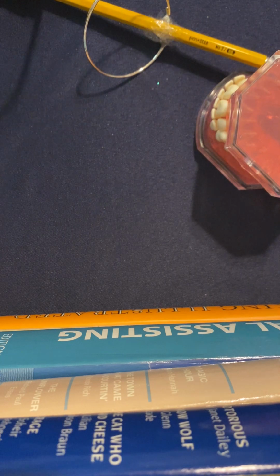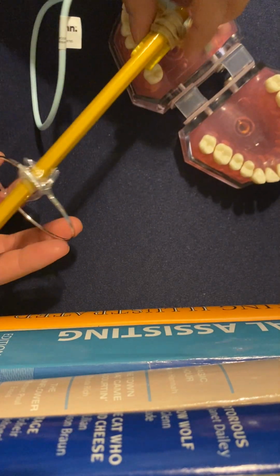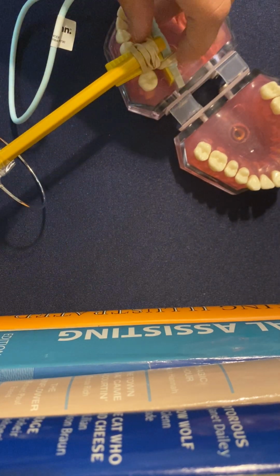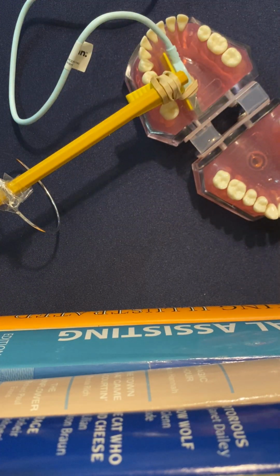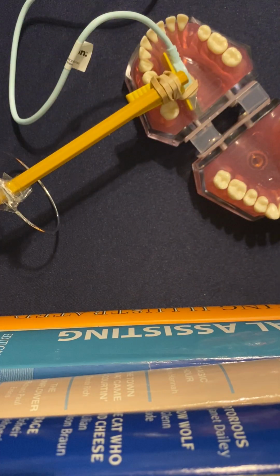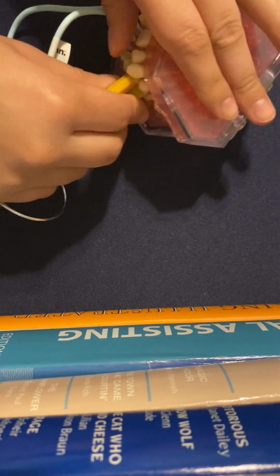All right. Number 10 is the mandibular left molar. So we're just going to shove it back here a little bit further. Get that midline if you can. You're going to want to center it on the second molar, which is this one. The teeth that you're going to want to see are the first, second, third molar, crown, and apices. This typodont does not have his third molar. He never came with them. And you're going to bite down. Going to center that on there, bite down. Here you go.